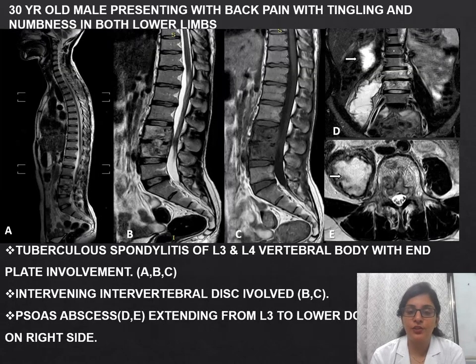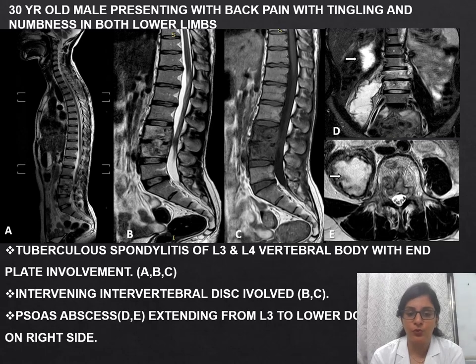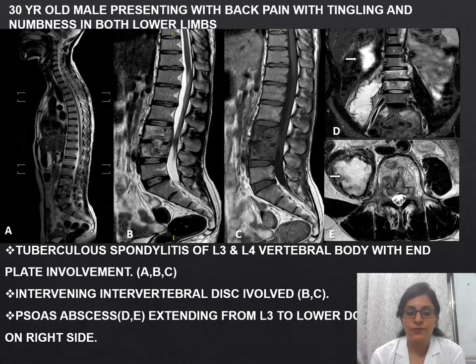Next patient: a 30-year-old male, presenting with back pain, tingling and numbness in both lower limbs. MRI shows tuberculosis spondylitis of L3 and L4 vertebral bodies with end plate involvement. The disc is also involved, and there is a psoas abscess from L3 extending downward on the right side.